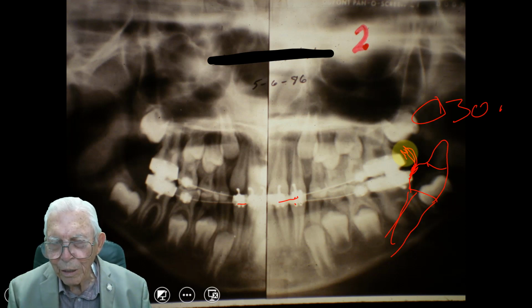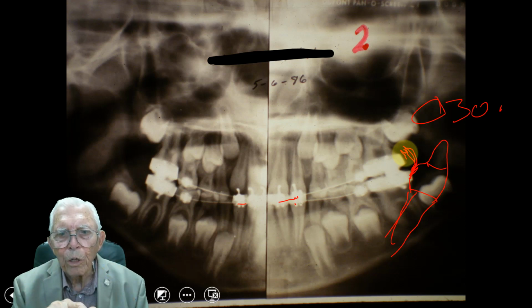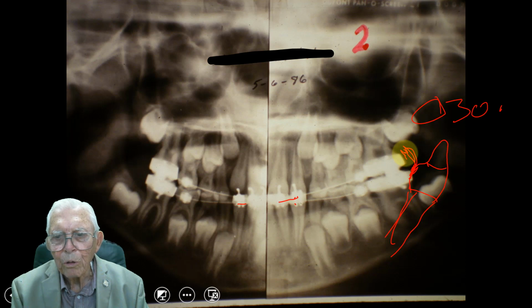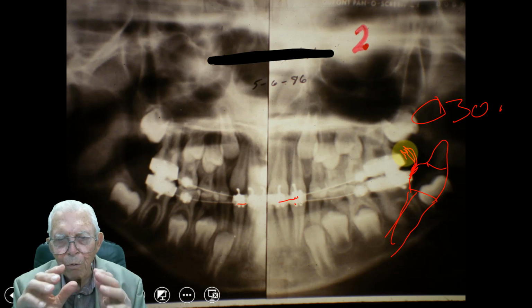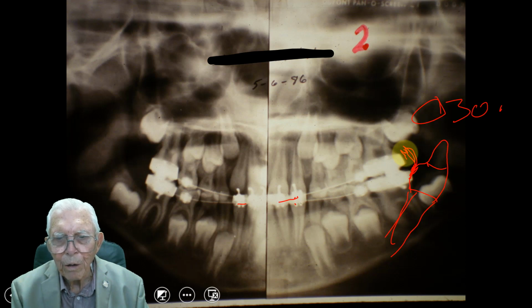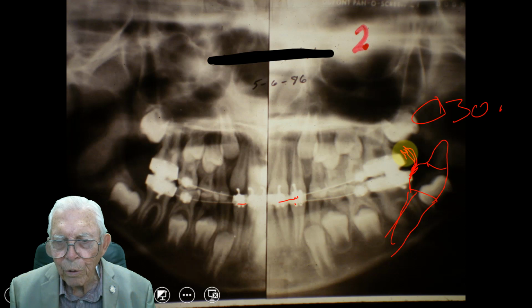And you can break a tongue thrust like that, but you need to open the airway first. You need to get the airway open before you try to stop the person from swallowing wrong. So we put the tongue thrust appliance in there, but then I get the adenoid tissue removed, or get the airway open. If it's an allergy case, it's really tough to keep somebody breathing through the nose and stop them from breathing through the mouth. That's hard to do.